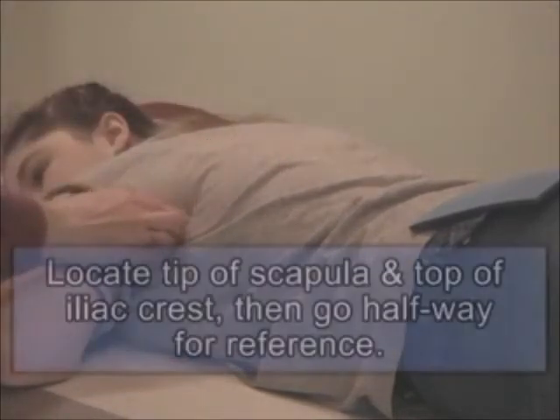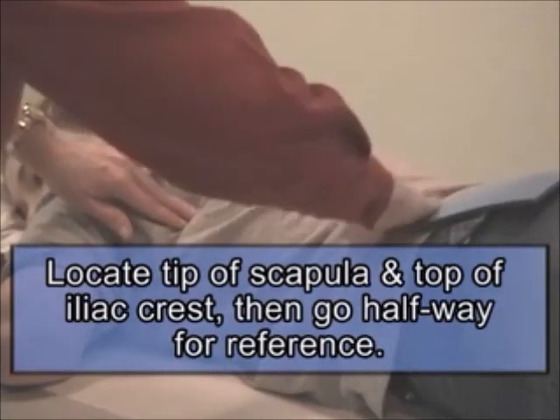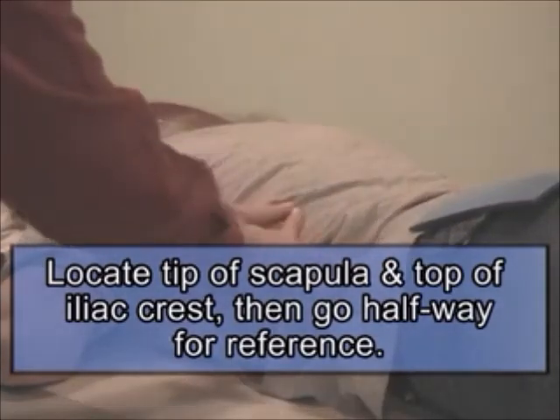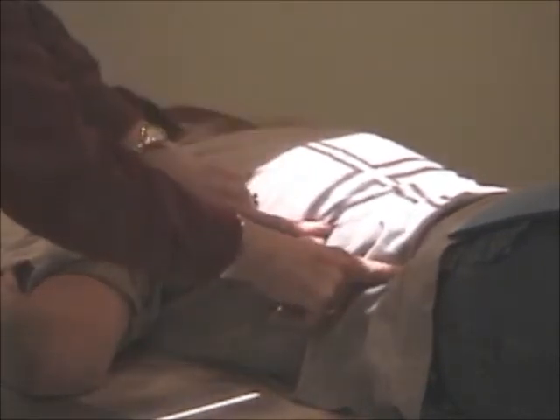I'm going to find the tip of the scapula, top of the iliac crest, feeling posteriorly, and go halfway. Okay. Again, tip of the scapula, iliac crest, go halfway. That should be at the approximate level of L1, L2. Here's the crest, 2 inches above is L3, so you can see that I've confirmed that I am at the level of L1 or L2.